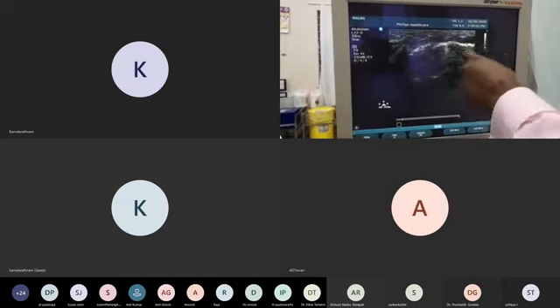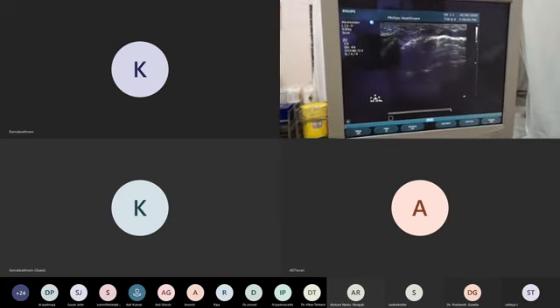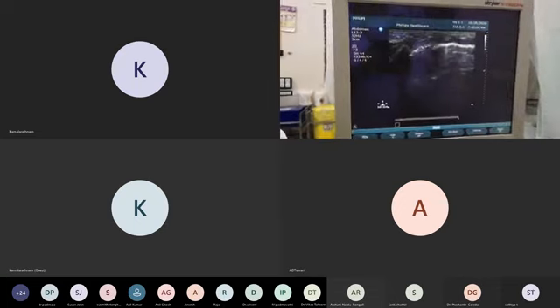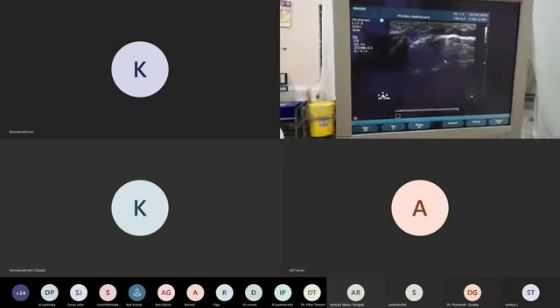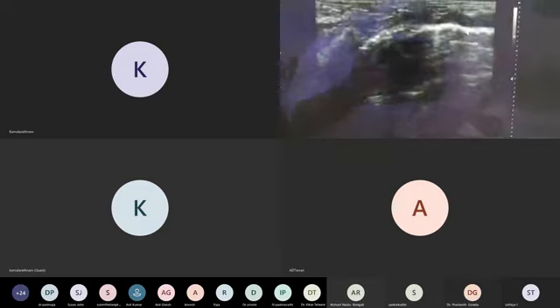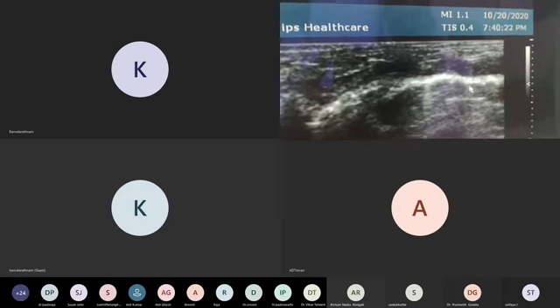Because here if you see a tissue-like sign, shred-like sign, and then you try to remember all those things, it means more reading, more confusion. So read less, do practice. It is better. So here perpendicular is there. And one more thing, I want you people to follow my arrow. You come near. Yes. Can you people see the arrow?